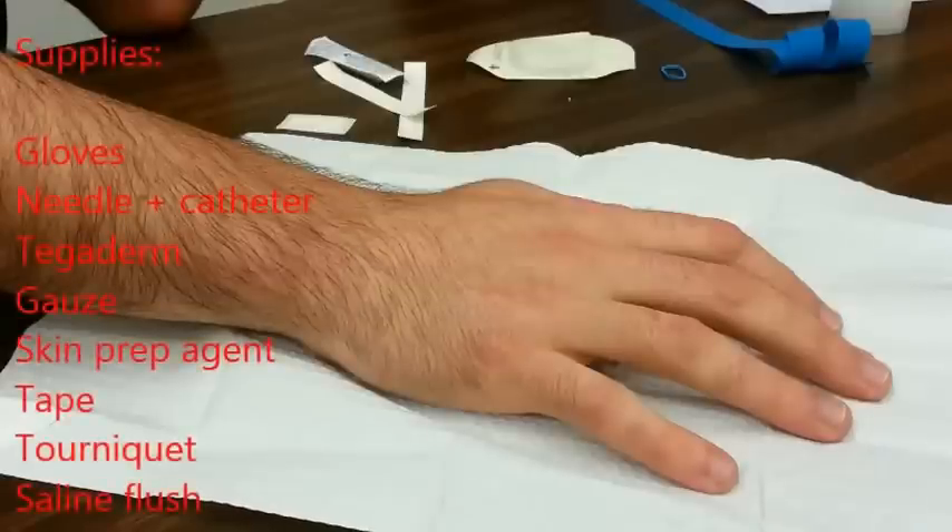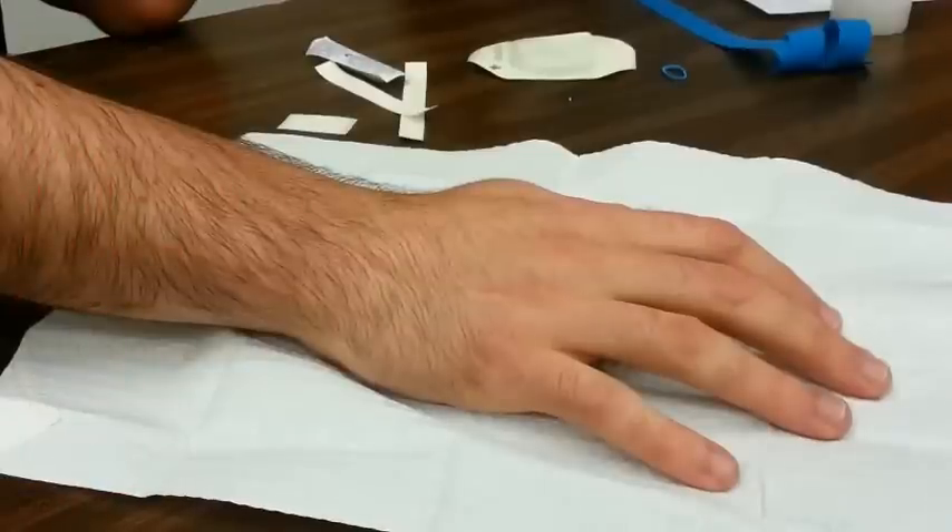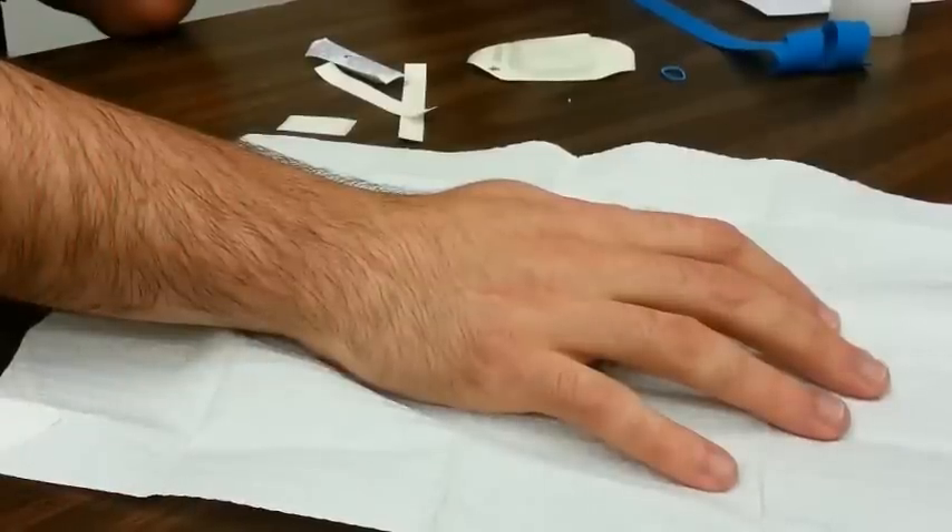We have all those things laid out on our table. You may also need a 10 milliliter saline flush, which is used to determine whether you're in the correct location and to determine vein patency. You may also want to tear your tape into strips and attach them to the side of the table so you'll be completely prepared to tape your IV in place.